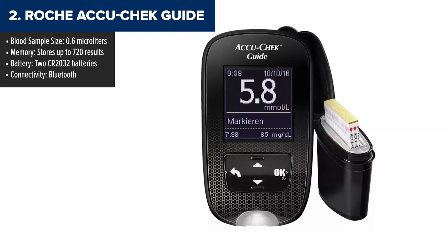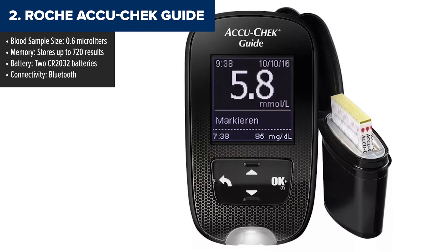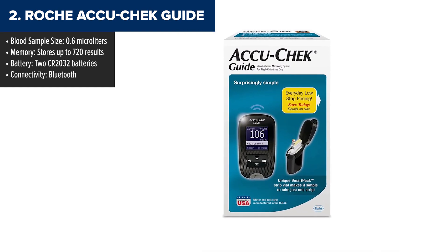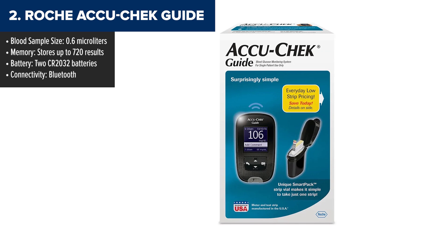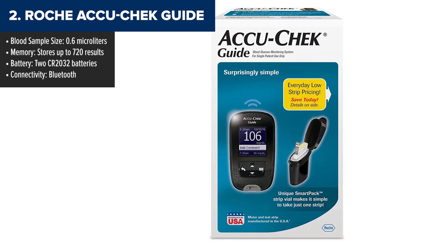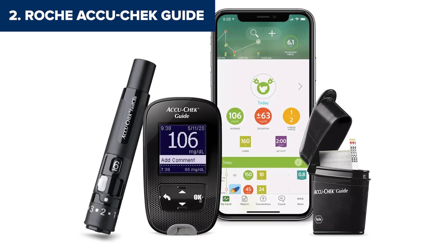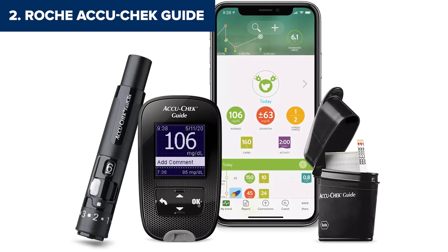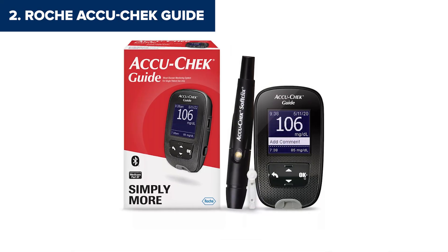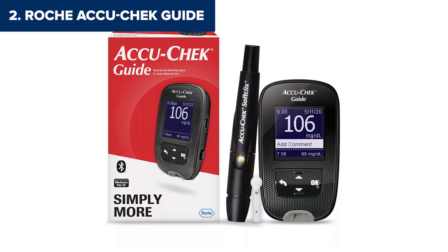In second place, we have the Roche AccuCheck Guide. This monitor is packed with thoughtful features that make managing diabetes as convenient as possible. If you're tired of fumbling with test strips or struggling to test in dim lighting, this one's for you. The AccuCheck Guide comes with a spill-resistant SmartPak vial that keeps test strips organized and easy to grab, even on the go. The backlit display and strip port light make testing in low light a breeze, and a strip ejector button means you don't have to touch used strips — pretty hygienic. Bluetooth connectivity also lets you sync your readings with the AccuCheck app to track your progress over time.